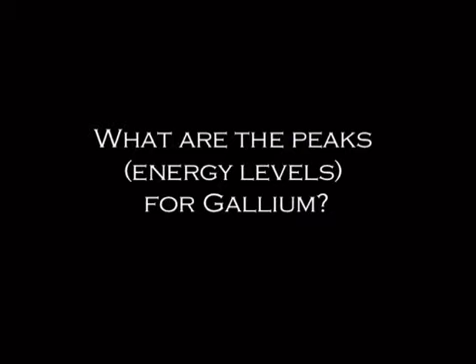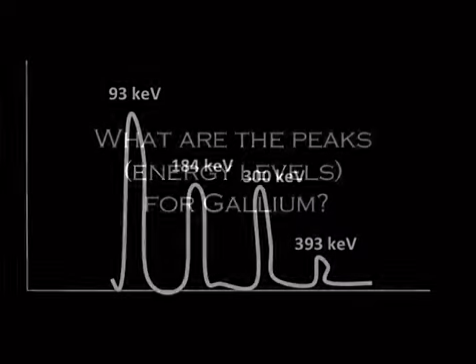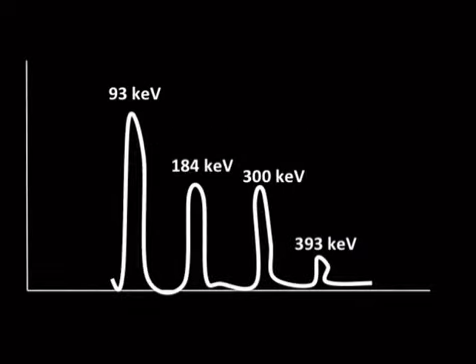Just like with thallium, it's important to know the peaks, and there are 4 with gallium. The way that I remember this is 100, 200, 300, 400. I think that if you've got a really excellent memory and you can remember these things as separate, then go for it. If you're in a hurry or you just got to memorize what you can, 100, 200, 300, 400.